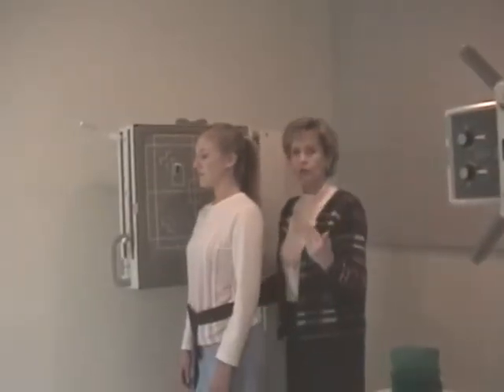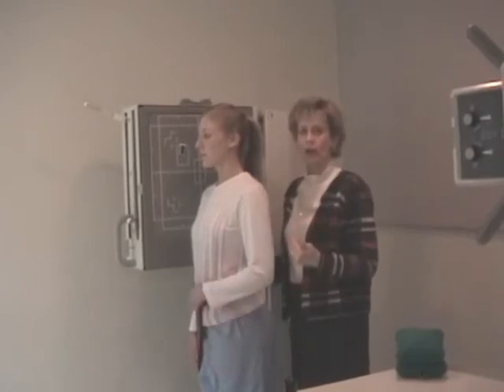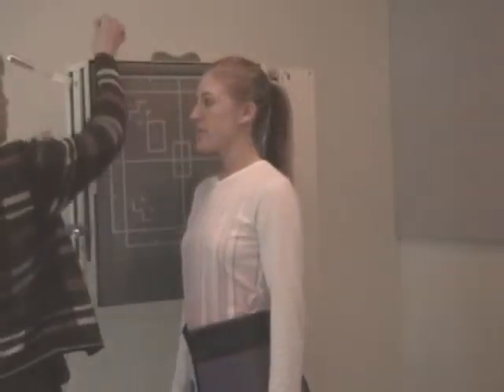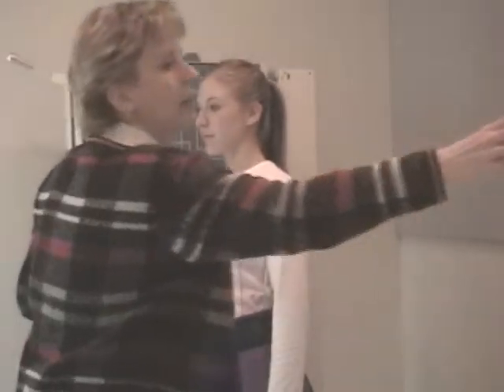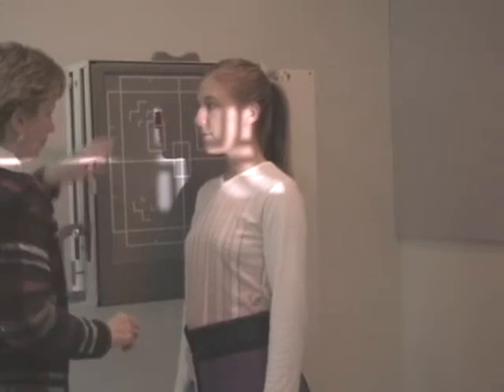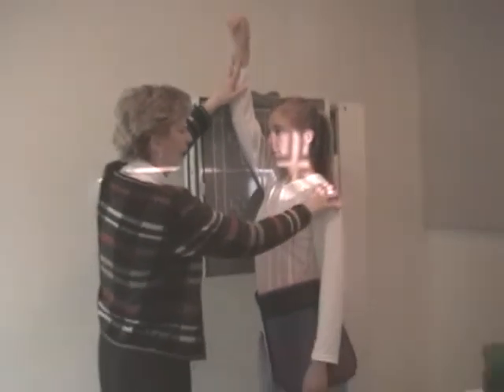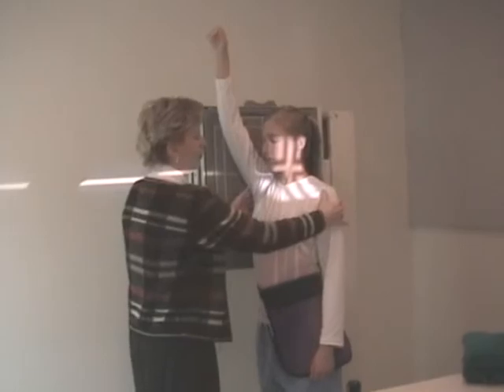Again, this is an alternate. You have to demonstrate C7. You couldn't do it any other way. We're going to do a swimmer. She's fixing her shield for me. I'd be having a right marker on there. You're going to be using the 10 by 12 again. Same SID. And think of swimmers. One arm up, one arm down, one arm forward, one arm back.